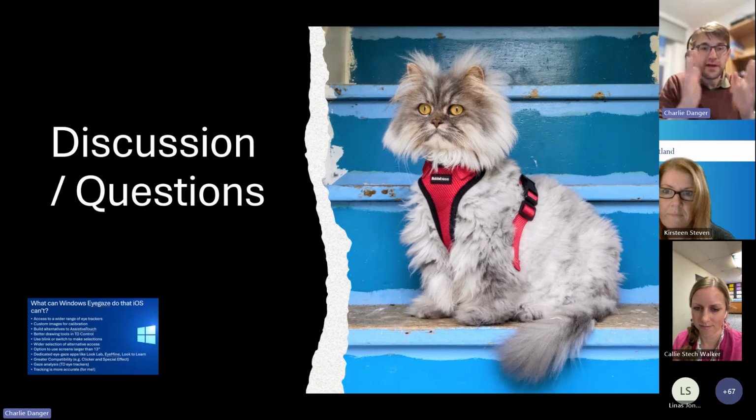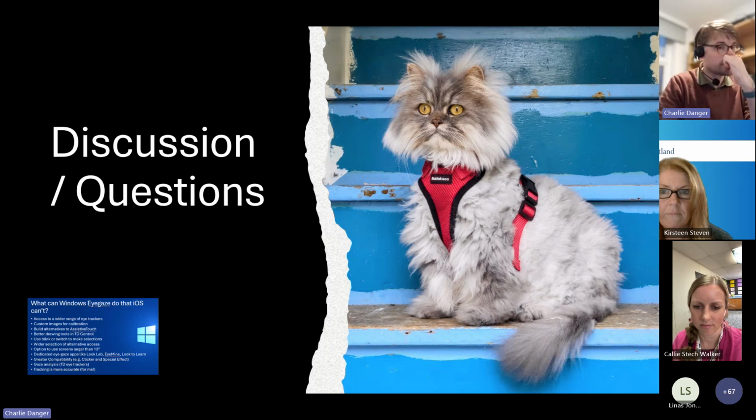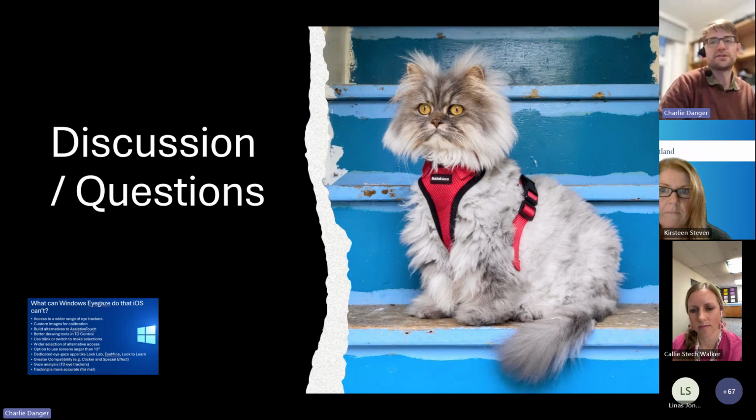My eyes are fairly well conjugated. They're well nourished, and all the other things that you require for good eye gaze. The only thing I've got is a slight strabismus or slight squint. And there's also, we don't have tools like gaze analysis. As I said, we don't have monocular eye tracking. There's lots of things that are missing that I would use on a daily basis in my assessment clinics.